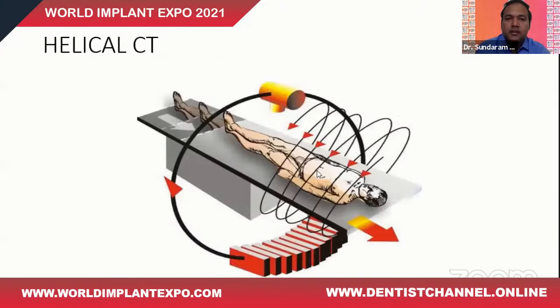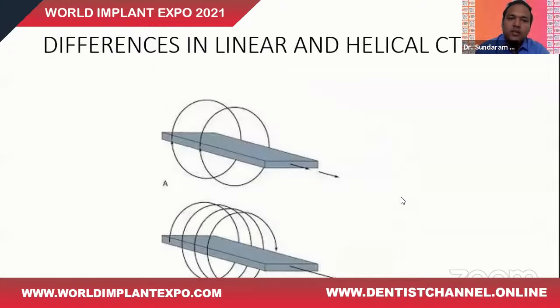So there was the next development in the field of CT, something known as helical CT. The source of the X-ray kept revolving around the patient in a spiral motion, giving us the valid information as we need it. So that is all about helical CT.